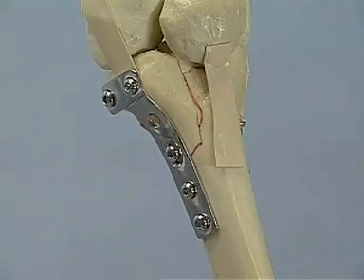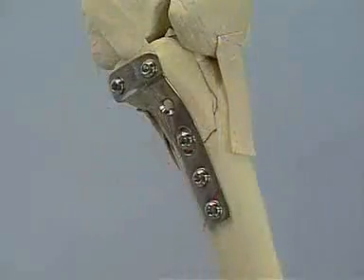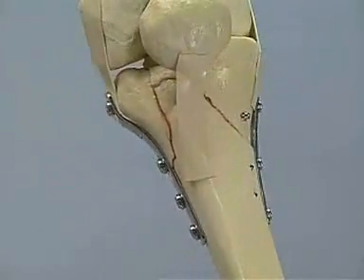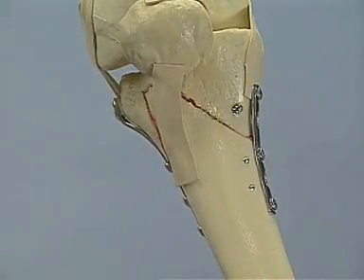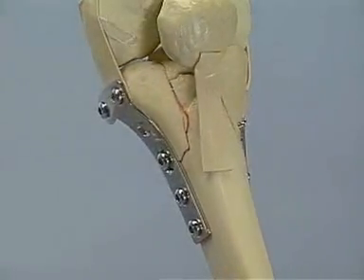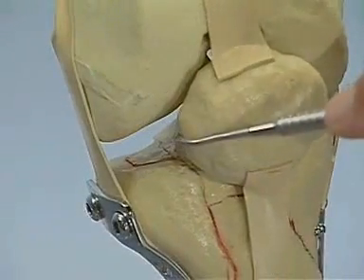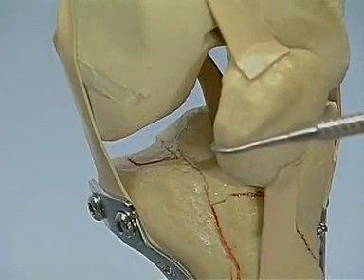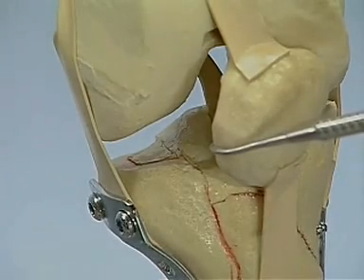Once the distal cortical screws have been placed, the reconstruction of the lateral side is concluded, while medially more screws could be added. The quality of the reconstruction of the articular surface may now be judged by inspecting the joint surface, while x-rays allow the correct axial alignment to be confirmed.